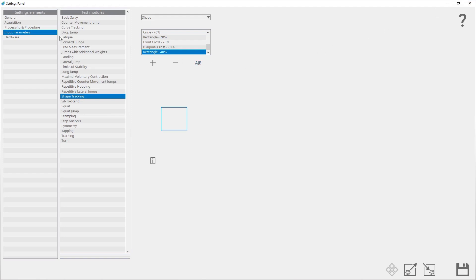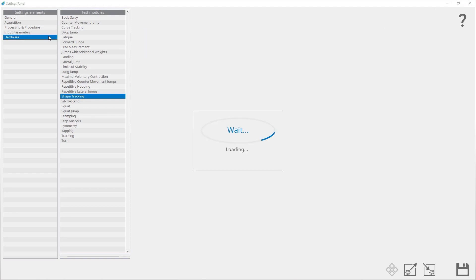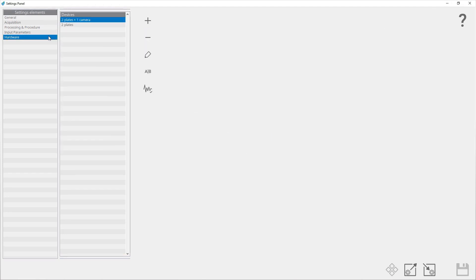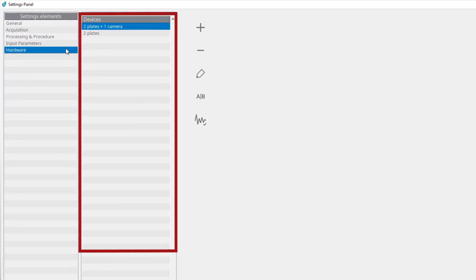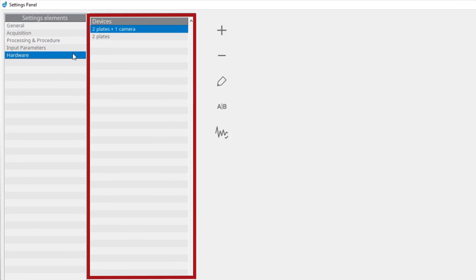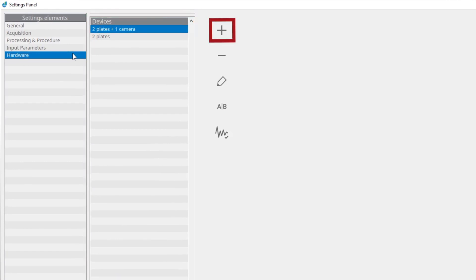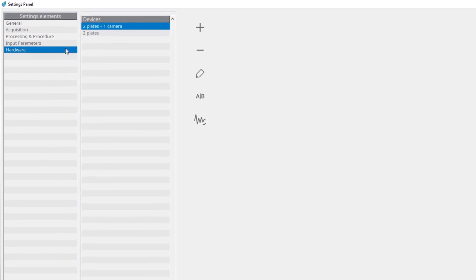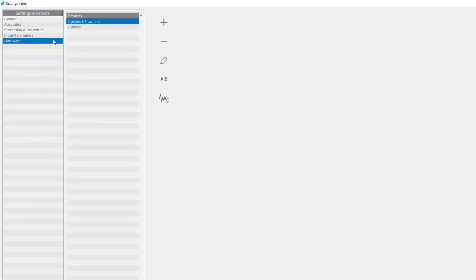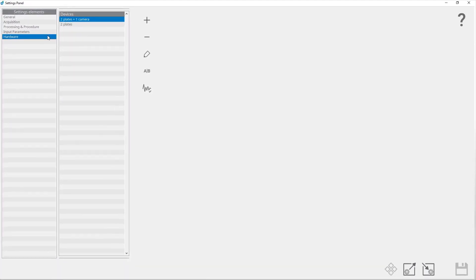In the hardware panel, you can set the parameters for the force plate and camera. Under devices, a list of all configured devices is shown. You can add a new device, edit an existing device, or delete a device. For more details on how to add or edit a device, see tutorial number four: hardware setup.